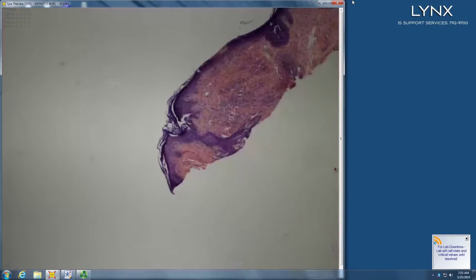When I think about syphilis, think about syphilis. Oh, syphilis. Well, with the endothelial swelling, yes. Lots of EOs, unusual, more bug bite like. And then, do patients with scabies, can they also have syphilis? They can. But this one, I think you can account for everything you see just by the scabies and the arthropod-like reaction.